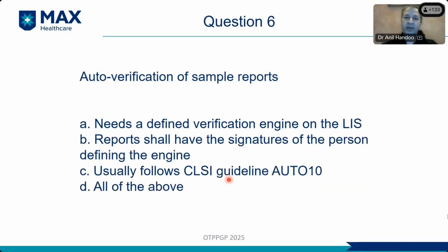So a quick question again: auto-verification of sample reports needs a defined verification engine on LIS; the reports shall have signatures of the person who defines the engine; usually follows a CLSI guideline AUTO10; or all the above. The answer is... All of the above, sir. Absolutely. So whenever we have a question like that, all of the above is the answer, and all of the above is the answer for sure.